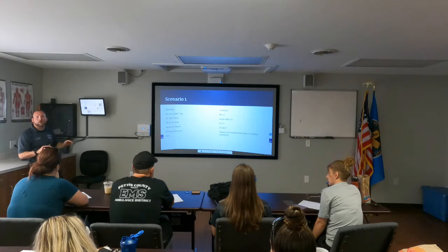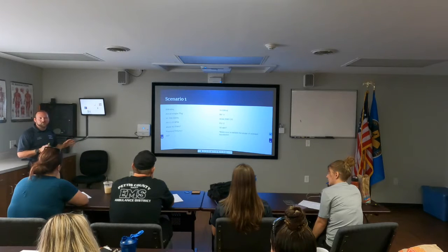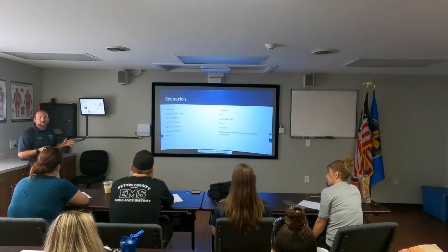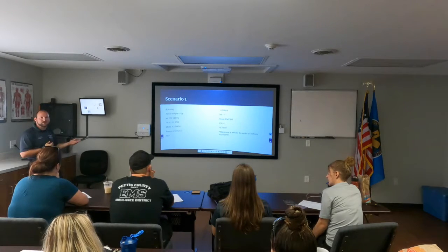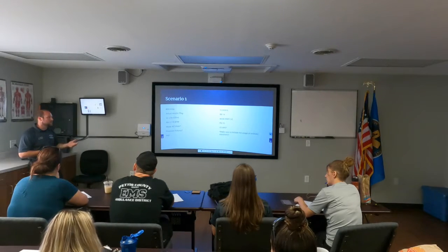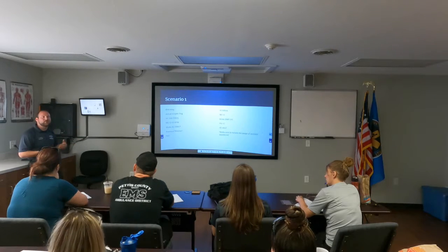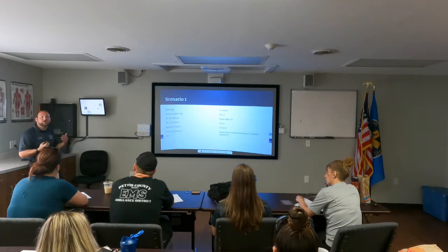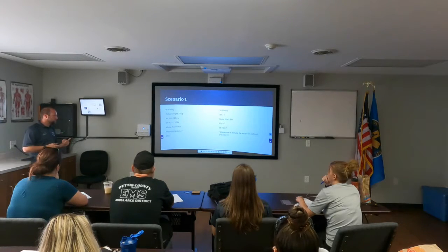It is the most common vent setting that you will see initiated for intubated patients in the hospital and pre-hospital setting. So it's not a bad starting point for this individual. Just know that if you're taking this patient on the vent, or you have a longer transport and you're not going to Buffalo, so you're going to Columbia or to Kansas City, maybe you're going to have to make some changes as the paralytic wears off or as they become more comfortable with it to better support your patient.